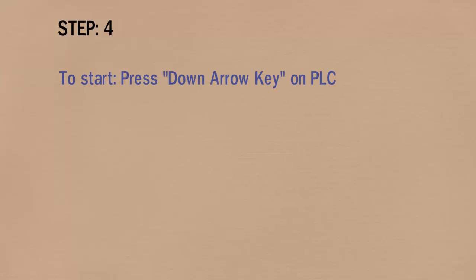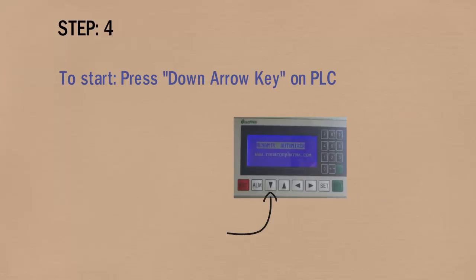In step 4, to start, press the down arrow key on the PLC.